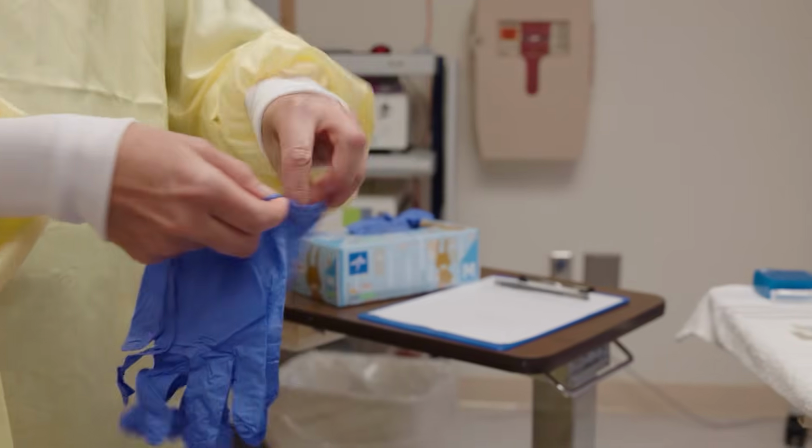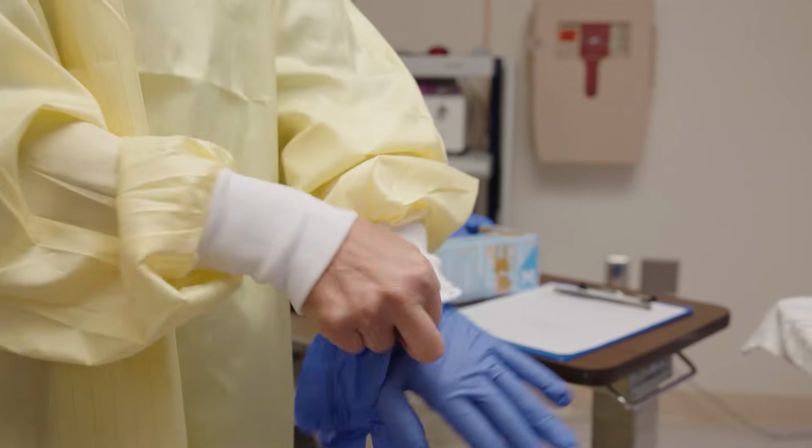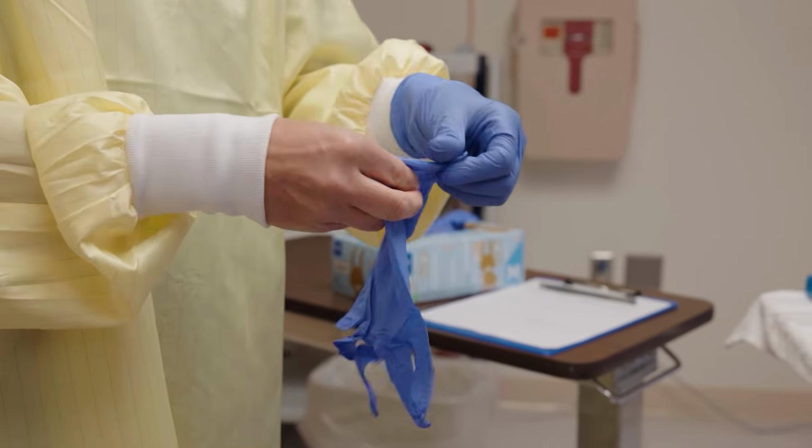Sweat induction is performed on one side of the body and then the other, never at the same time, and current should never cross the heart. Remember to always wear personal protective equipment following your institute's guidelines and CF-specific infection control for patients known to have CF.